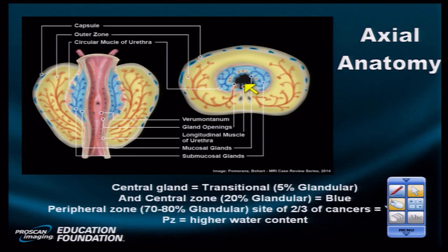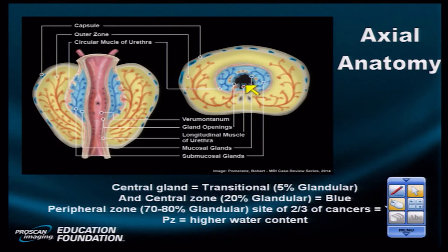Here is an axial image of the prostate showing the region of the urethra, the periurethral glands with some gland openings. It's not uncommon for these to dilate and for you to get little periurethral cysts, sometimes arising from the prostatic utricle or the region of the verumontanum, which we see here in the coronal projection.